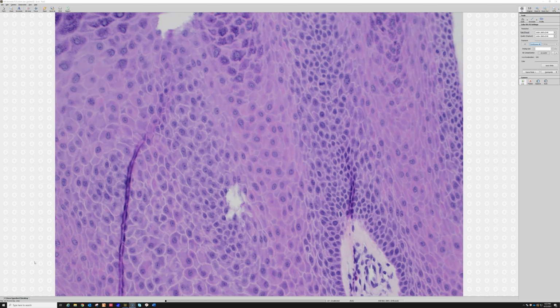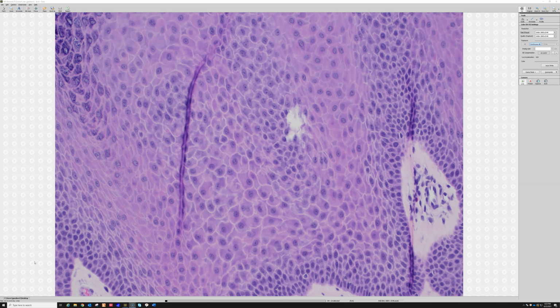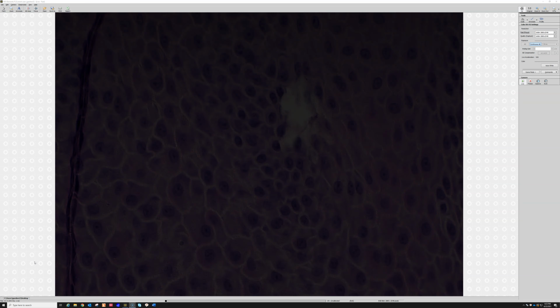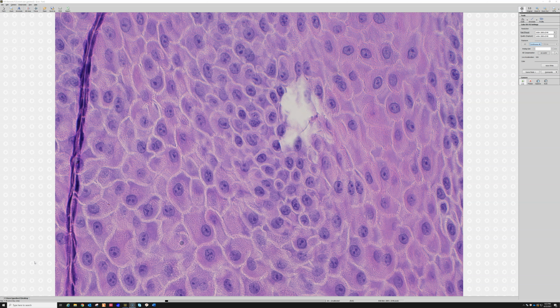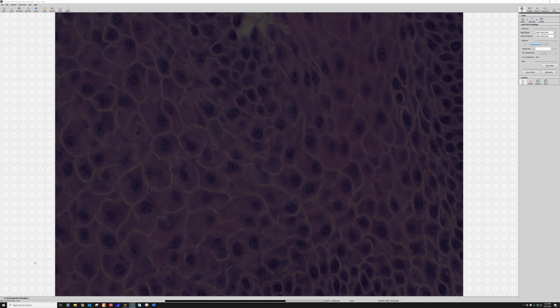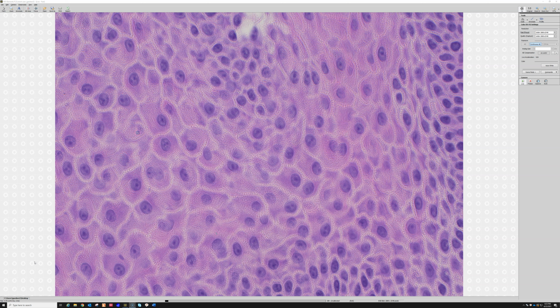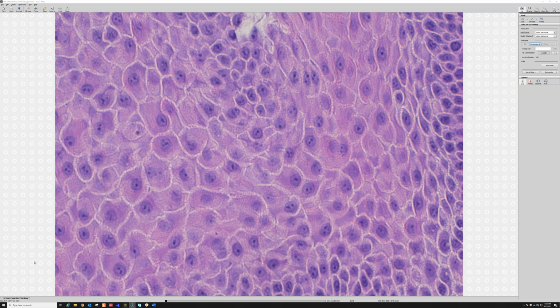All right? And look, you also can notice the spines here. The desmosome spines show up beautifully. Look at that. Oh, it's amazing. I never, ever get tired of seeing those desmosomes. It's so incredible. If you are not excited and happy about seeing this, then I cannot help you. I mean, look at that. I look at skin all day long, and I still never get tired of this.